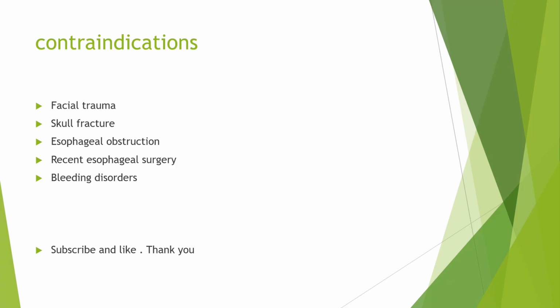Contraindications: it's contraindicated in facial trauma, any suspected skull fracture, esophageal obstruction, recent esophageal surgery, any bleeding disorder.